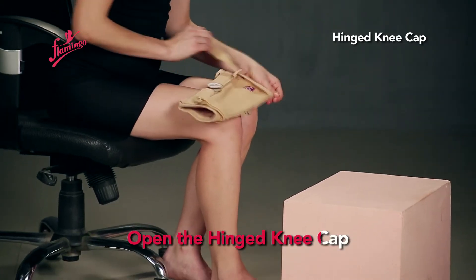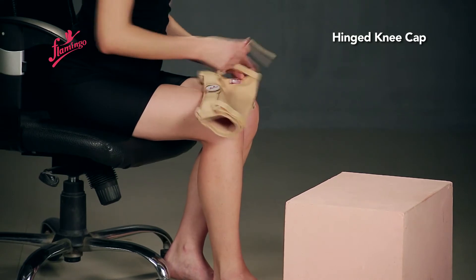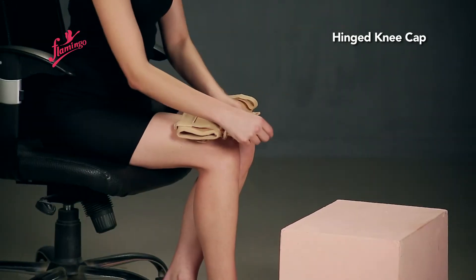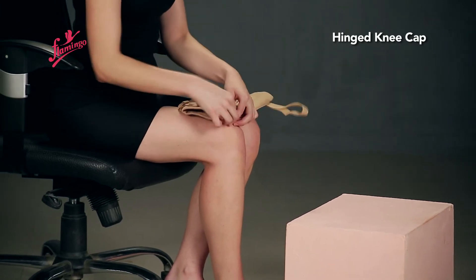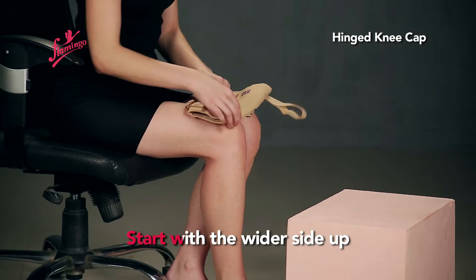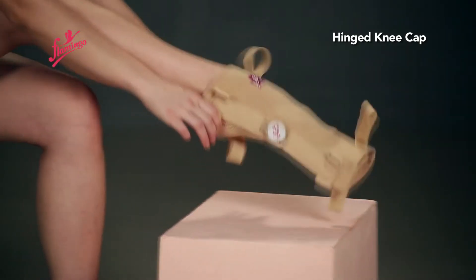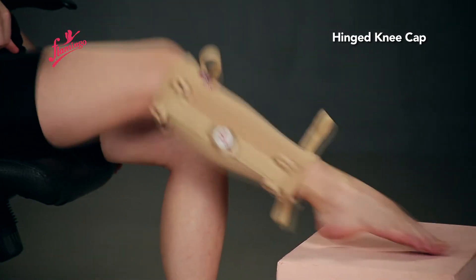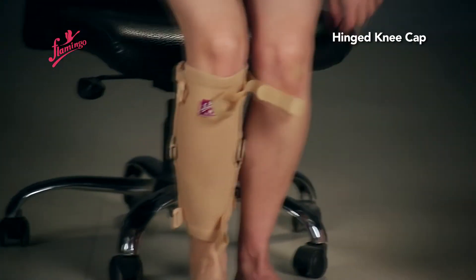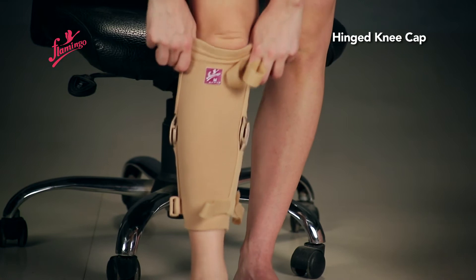Open the hinged kneecap. Start with the wider side up, then slide the hinged kneecap slowly over the knee.